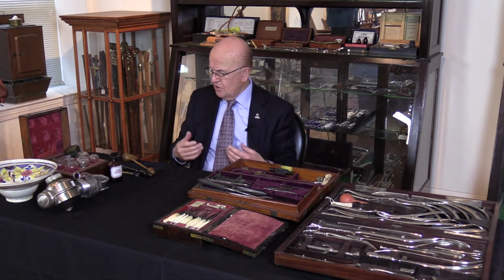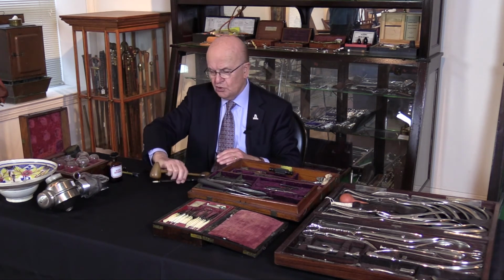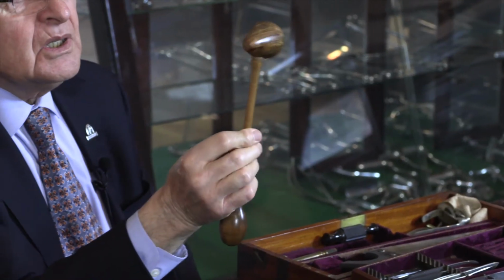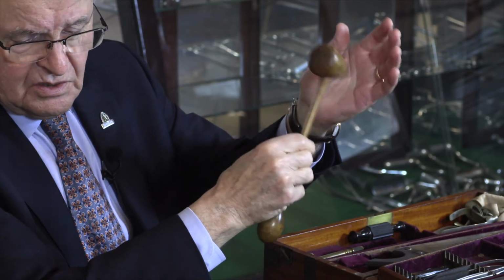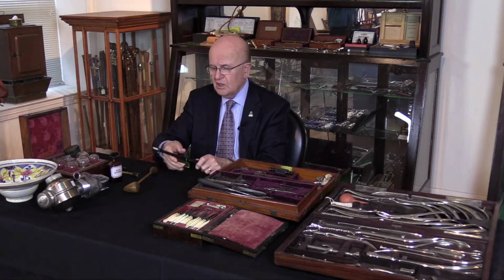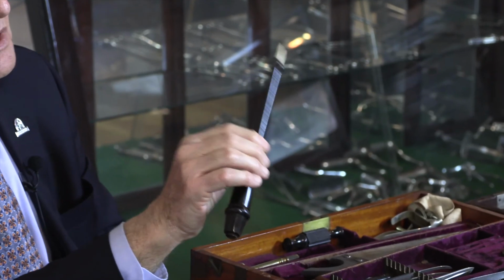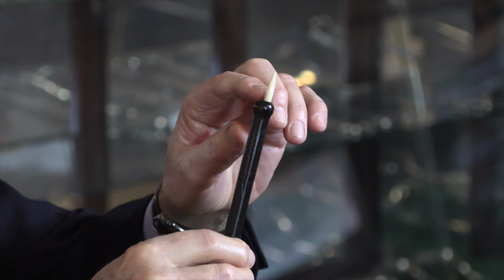Among the subspecialties in these galleries, there are neurosurgical instruments, and I chose a few just to share with you. This is a reflex hammer. It's all made of wood, and does the same job as a modern one to elicit the reflex. Also, I want to share this with you. This is used on the sole of the foot, Babinski, to see the reaction. It happens to be not very sharp, but that's what will elicit the Babinski reaction, and it's made of ivory.